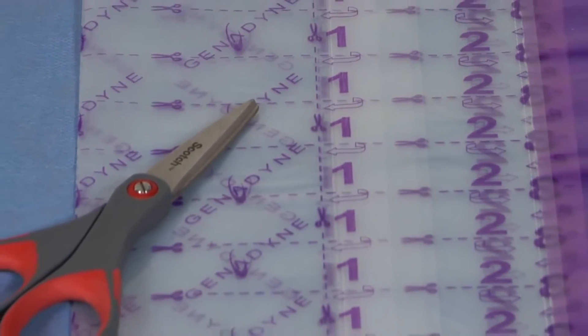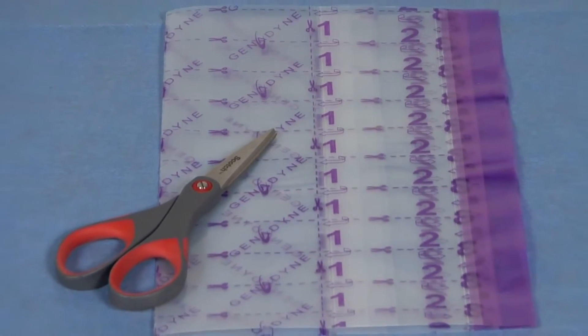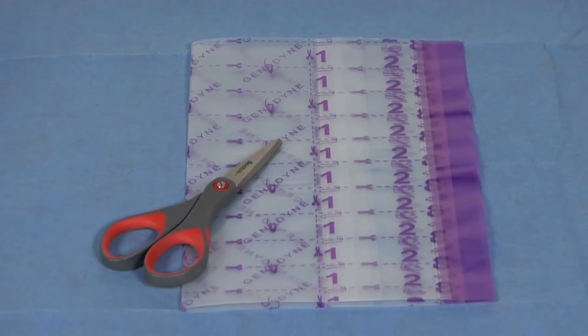Scissor lines are located on the transparent adhesive, ensuring a correct cut when matching the wound to the foam size.